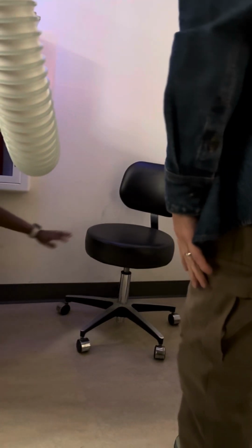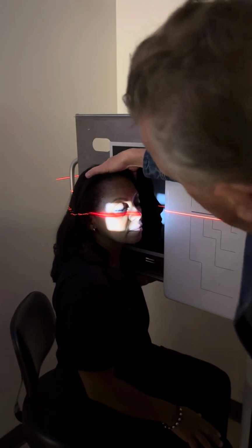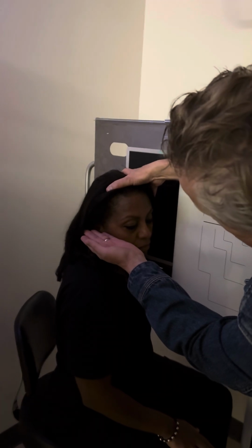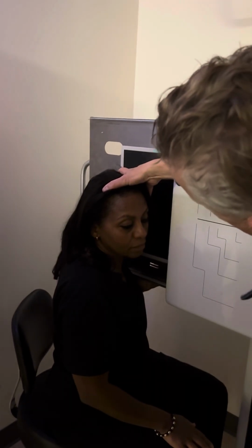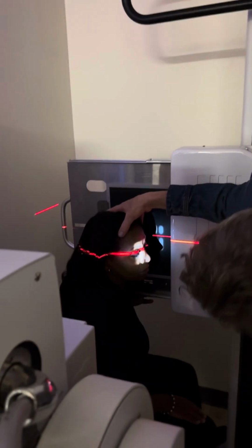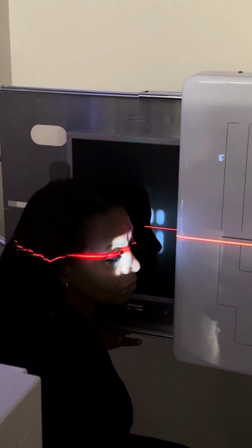I'm gonna see if I can use his vise. It's hard to do because it won't go far enough over, sorry. I'm clear over here. I'm gonna create magnification from it. So she's gonna put her feet there. I'm sorry, I keep pushing on you. I'm gonna push her laterally. I'm gonna drop the center ray to the IOML line, or actually determine where the IOML line is, which is what I'm gonna do to her right here, right there. Turn the light on for me, and then I'm gonna push her back. And I'm just gonna capture right there at the bridge of the nose, her nose. Right there. That's a left lateral for the nasal bones.